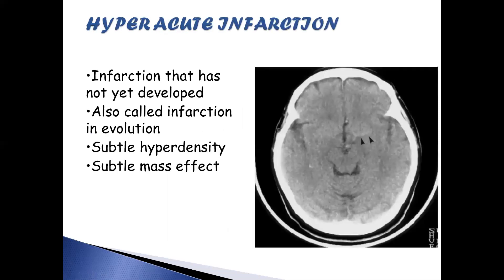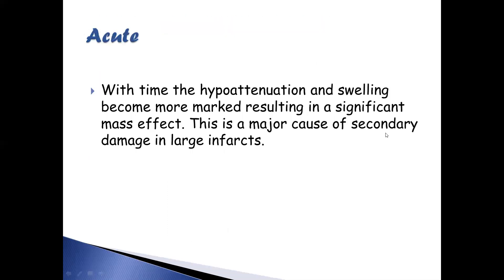Hyperacute infarction — where the infarction has not yet fully developed — is also called infarction in evolution. There will be a subtle hyperdensity and mass effect. In the acute phase, the hypoattenuation and swelling become more marked, resulting in a significant mass effect.